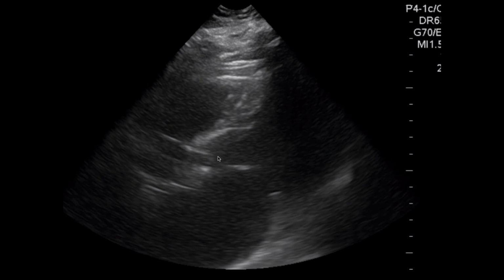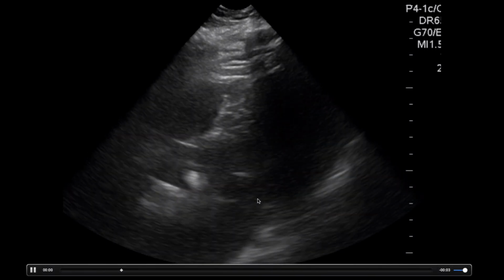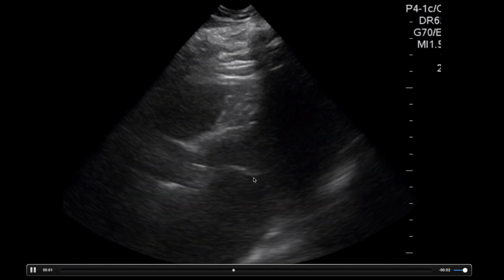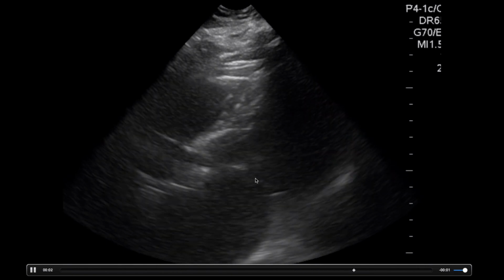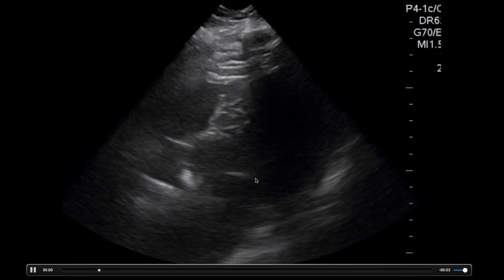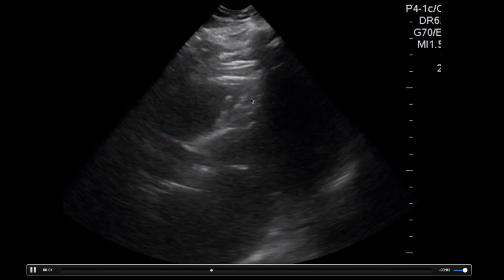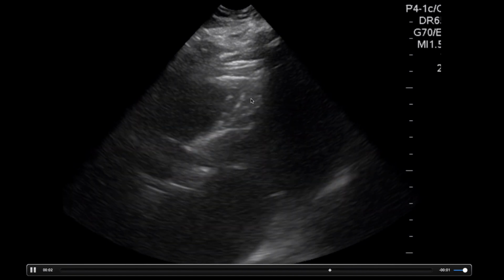Another example here, we have the left ventricle here, left atrium here. You can see the mitral valve. It is fluttering up and down, up and down, up and down. And valve movement in itself can be cardiac standstill. You may have no ejection fraction, even though the valve is moving a little bit. But here along the muscle, you can really see that fine movement that, again, is ventricular fibrillation.